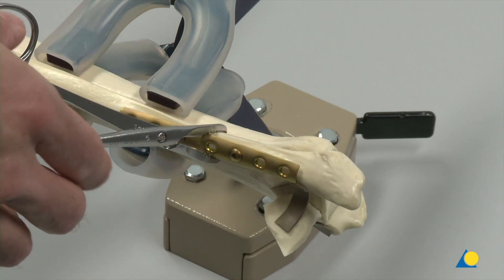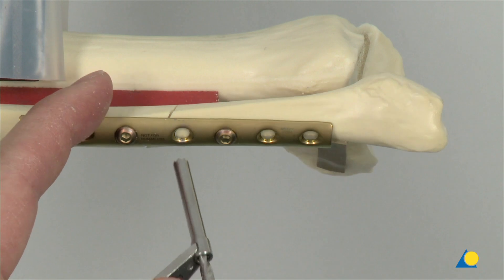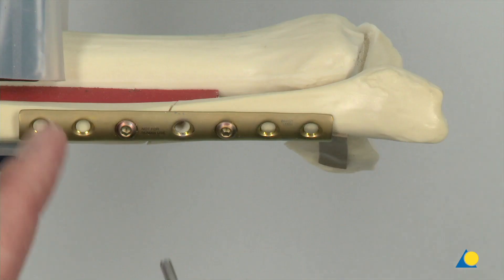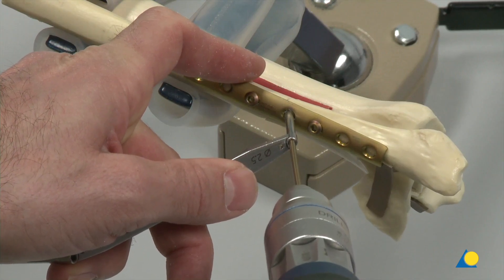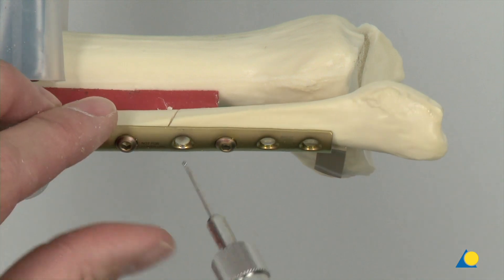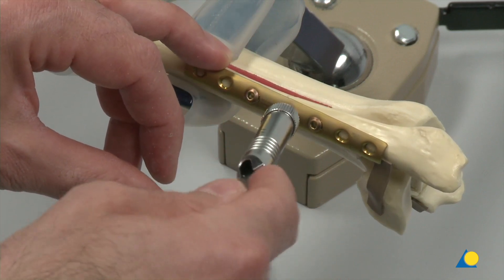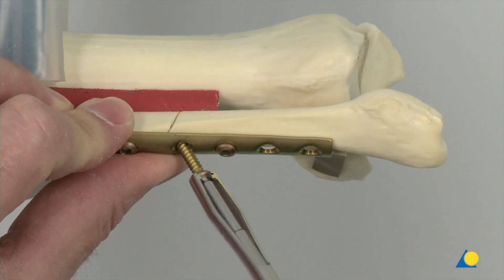The toothed reduction forceps is removed. The glide hole is drilled for lag screw insertion using the 3.5 mm drill bit and drill guide through the near cortex only. A thread hole is drilled through the opposite cortex using the 2.5 mm drill bit and drill guide. The required length of screw is measured using the depth gauge. The 3.5 mm self-tapping screw is inserted, functioning as a lag screw.